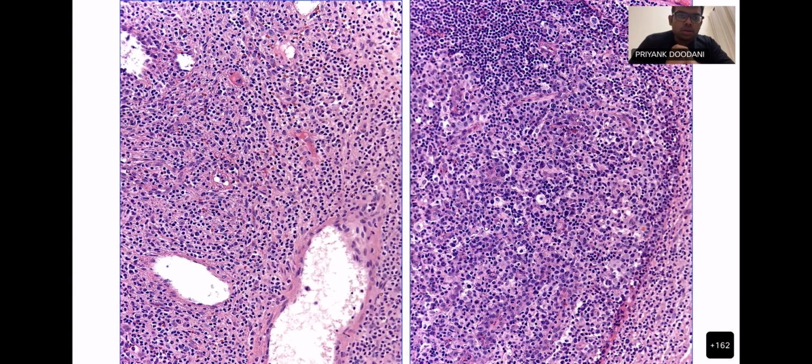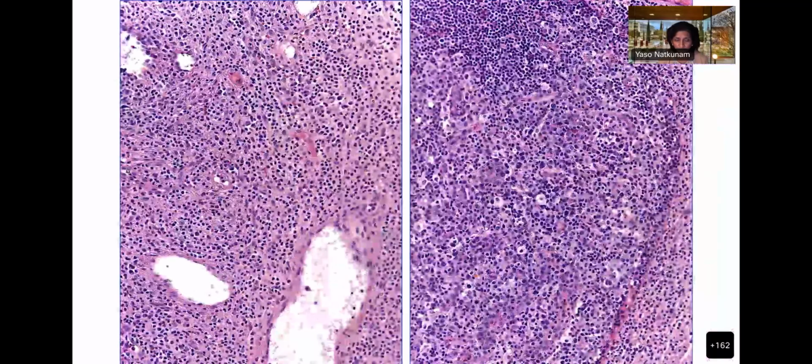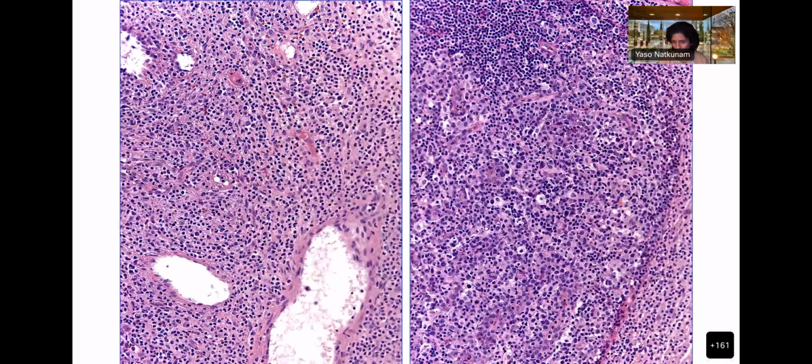So the next pictures are taken from the edge of one of these, like here. I'm actually focusing on one of the sinuses here, giving you a little bit more information, especially here. So you are seeing parts of a remnant germinal center here. I completely agree with your answer, brilliant answer. But this was a very difficult node to look at because it had parts that looked perfectly fine. Maybe this is part of a mantle, we don't know, small compact cells, but very disrupted. And this looks nothing like a normal node, right? It's clearly very disrupted. But these sinusoidal areas had things going on.